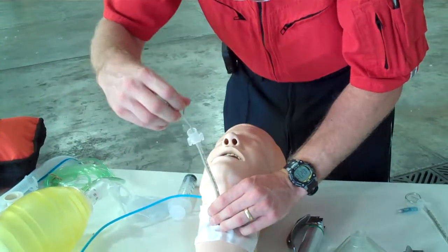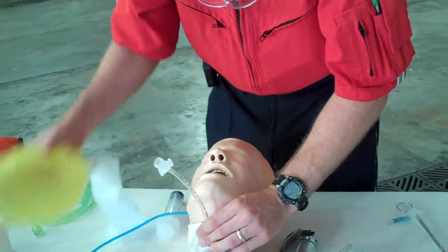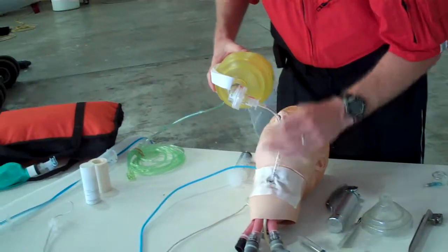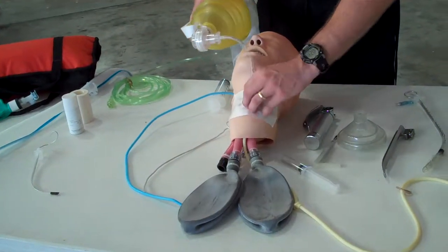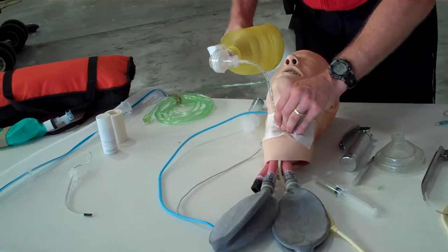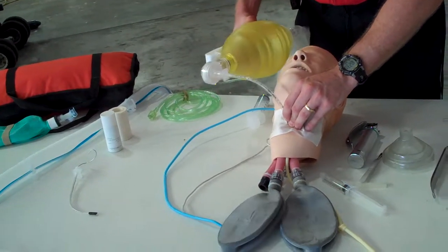Once that's in place, you remove your stylet, and you would bag the patient like you would in any other bag valve mask situation. And you can see here, I'm actually right mainstemmed on this, so I would pull the tube back a little bit so I can get both lungs. And there you go, it's opening up there.